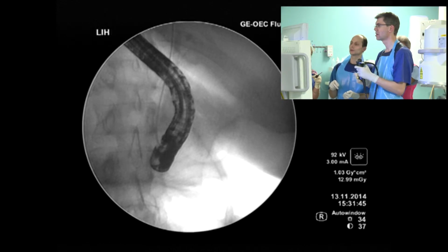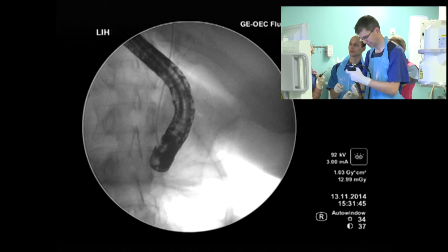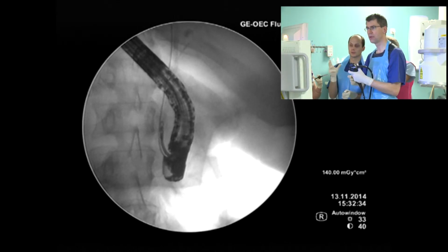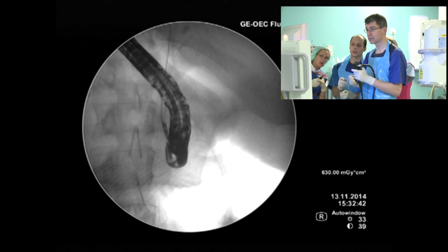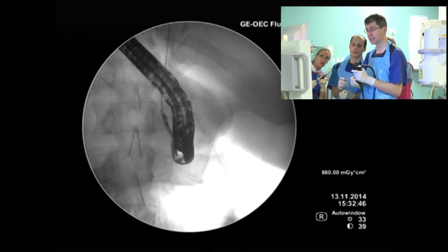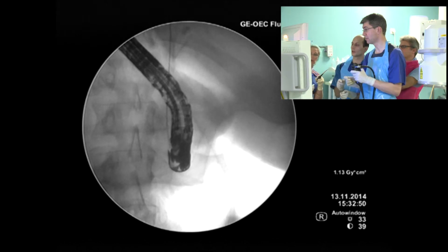And a couple words about the X-ray picture. What do you think about this X-ray picture, about this situation? Open the forceps, please. Open. Is it open? Okay. It's moving very easily. So I try to press. Yeah, now it's open. Good. Close. Yes. This is good. That's a good one. Hope I don't catch the wire. Good. Okay.